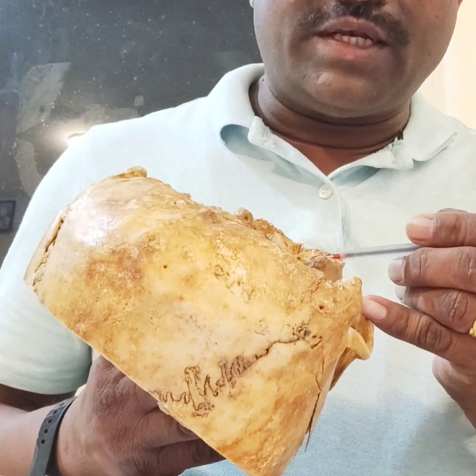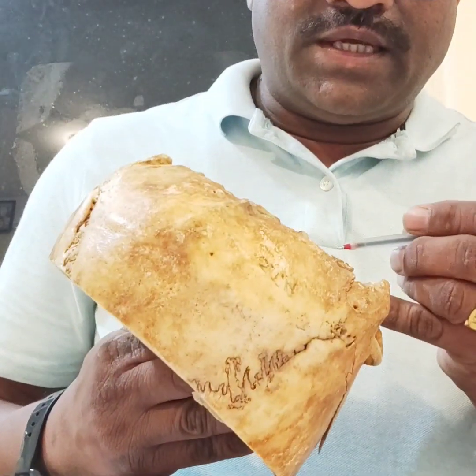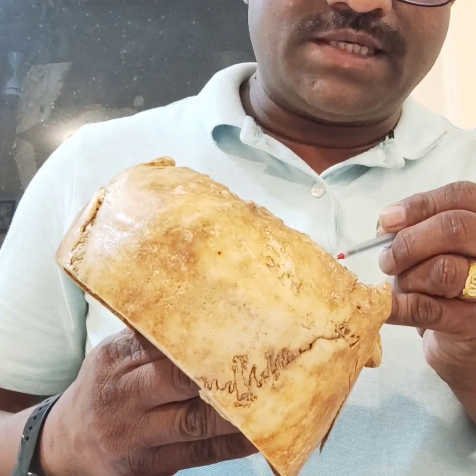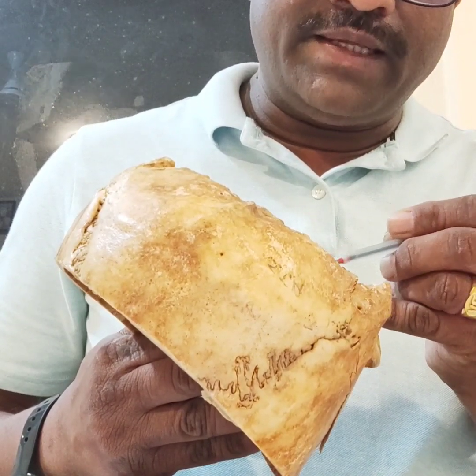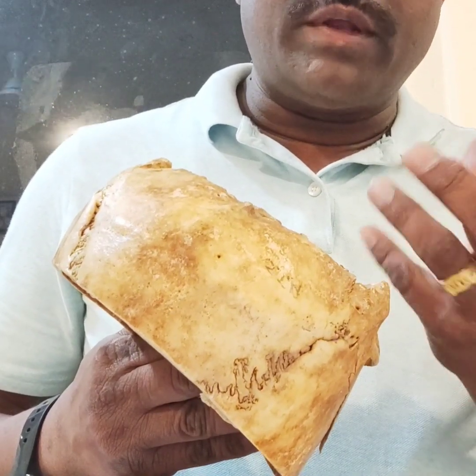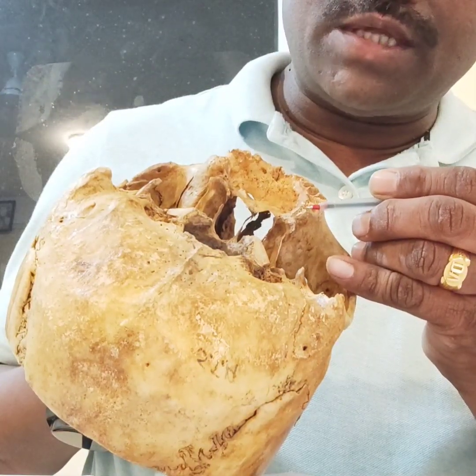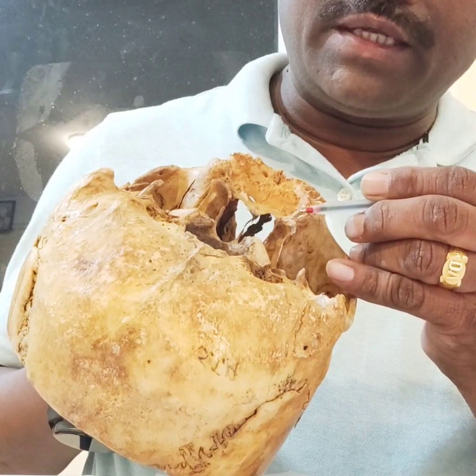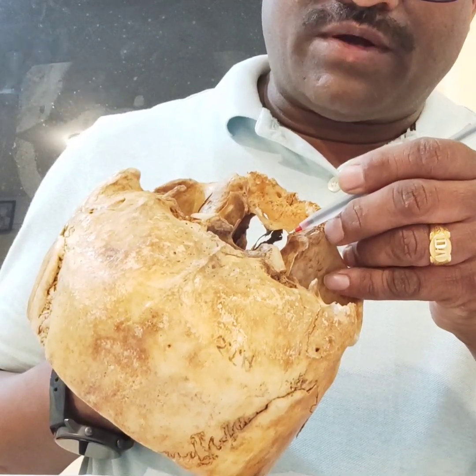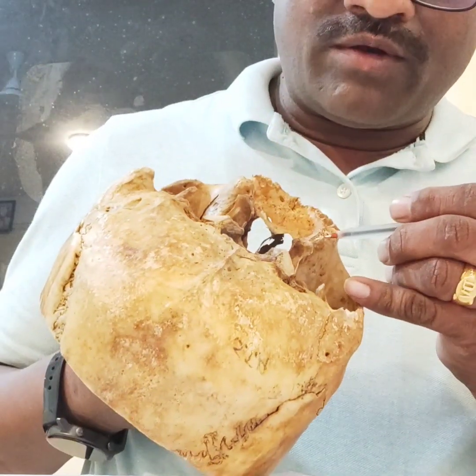Be careful not to do the osteotomy towards the lateral pterygoid plate. When there is atrophy of the maxillary tuberosity, your osteotomy should start from the distal root of the second molar, angulated medially along the line of the hamular notch. When the bulk of tuberosity is good, you can start from the buccal aspect of the tuberosity, angulated 15 to 20 degrees medially and distally, then proceed with the osteotomy.